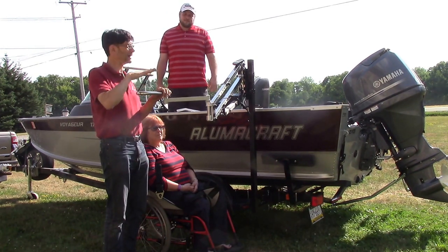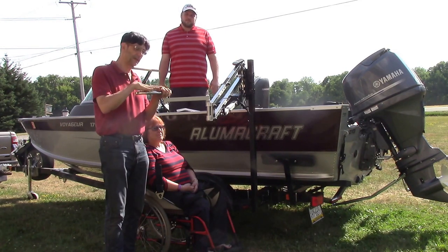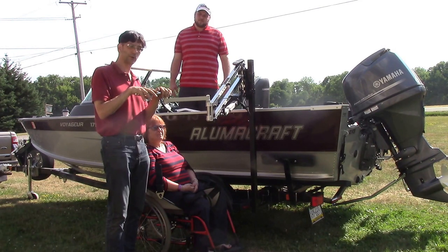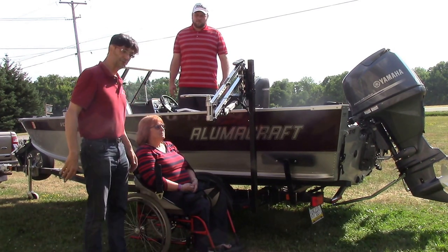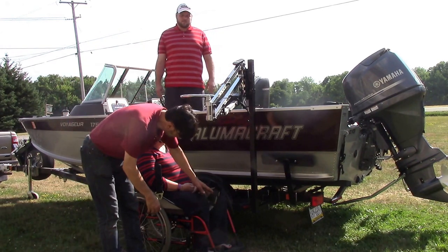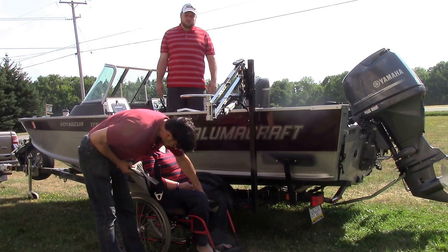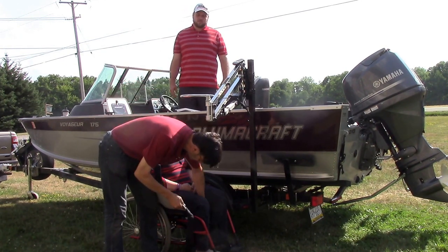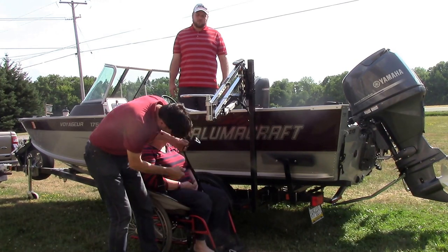The great thing is we can do this while we're dry or while you're in the dock or in the water. Of course you'll have to make sure that the dock is within the appropriate transfer height, same thing for the boat in the water. But for a large percentage of boats, particularly smaller craft, it does work really well. The Multilift uses a sling system — the back saver sling — and it's not actually under the person. You simply put the sling around the person and the only place it goes underneath is under the knees.